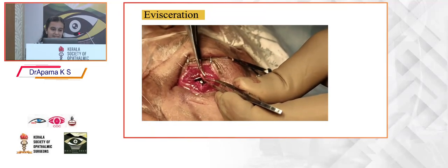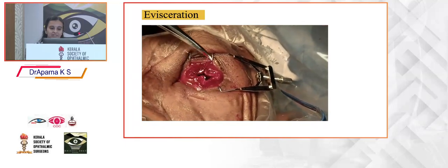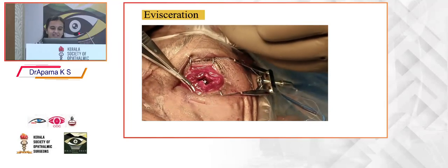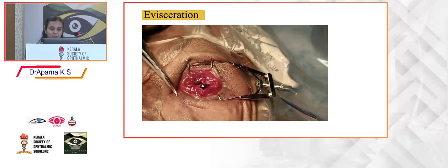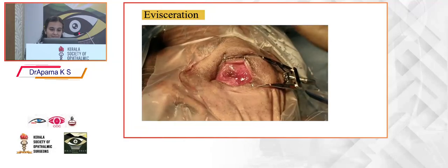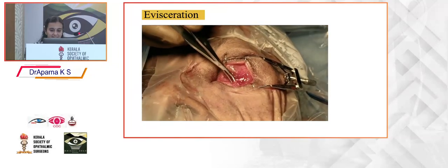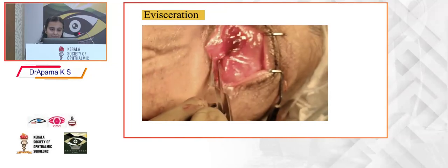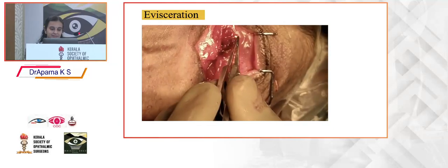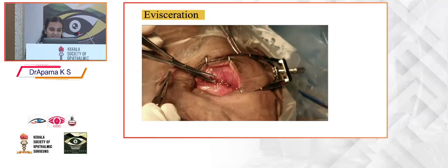Here the opposite petals are attached, and after that we have to suture the anterior Tenon's, then close the conjunctiva. So we will get a multiple layered closure of the implant that will prevent an extrusion. Here anterior Tenon's is sutured with 6-0 Vicryl interrupted sutures. Then the conjunctiva is closed with continuous key pattern sutures.